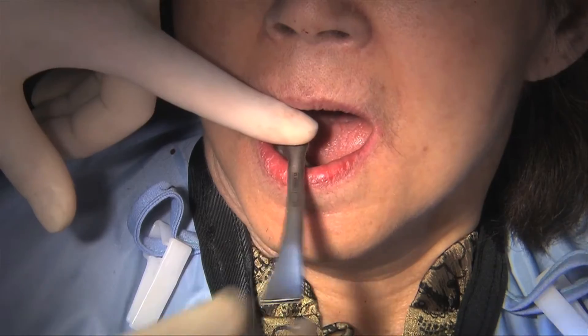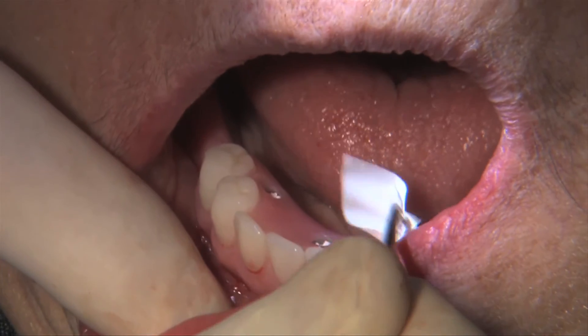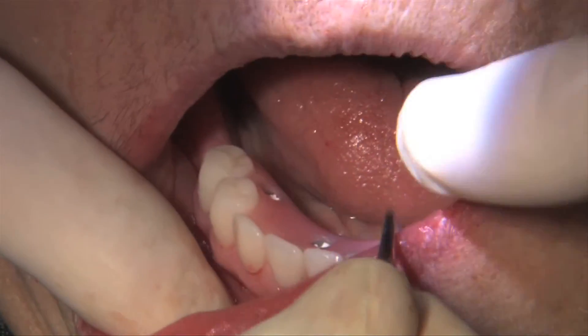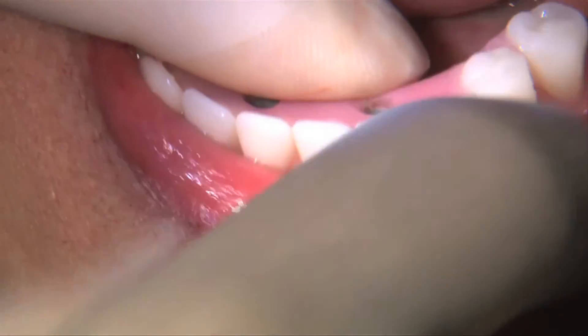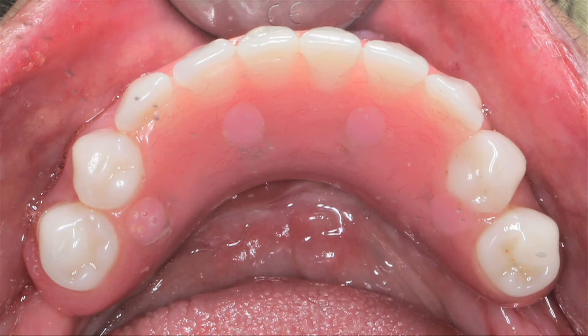Minimal occlusal adjustments were made immediately after delivery of the provisional prosthesis. Because the patient was still under anesthesia, obtaining an accurate repeatable centric occlusion was challenging. The patient's bite was adjusted during a routine post-operative check a few days later, and by the third visit her bite was comfortable and stable.